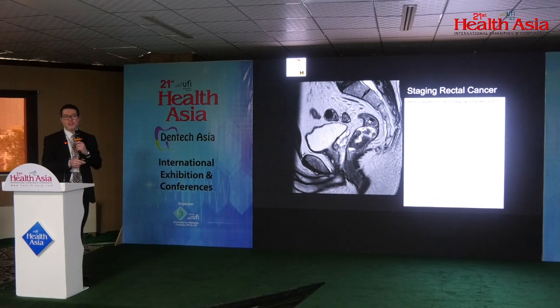It helps the oncologist, it helps the radiation specialist, it helps the surgeon to localize and decide in the multidisciplinary approach how to go about treating this patient. So it includes distance from the anal verge, distance from the anal sphincter, relationship of the anterior peritoneal reflection, the craniocaudal length of the tumor. We'll talk about the morphology and the mucinous composition.